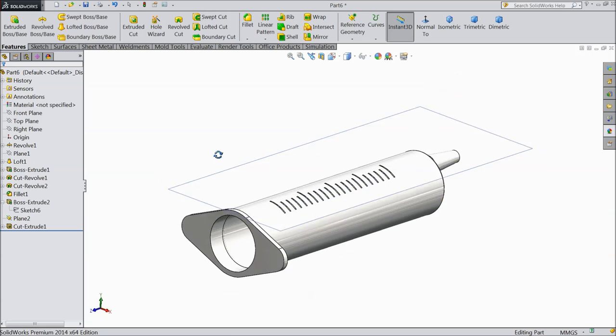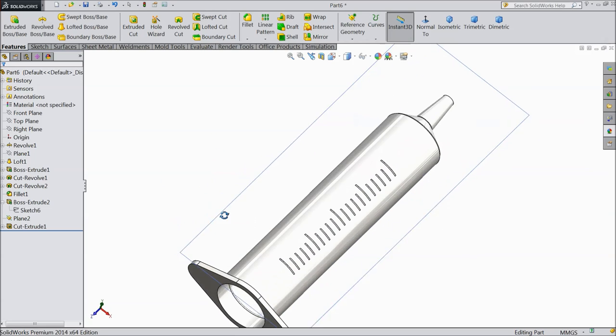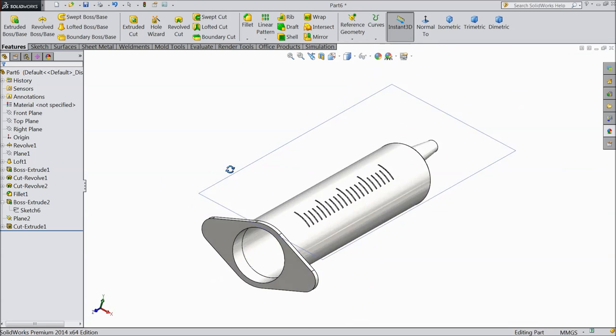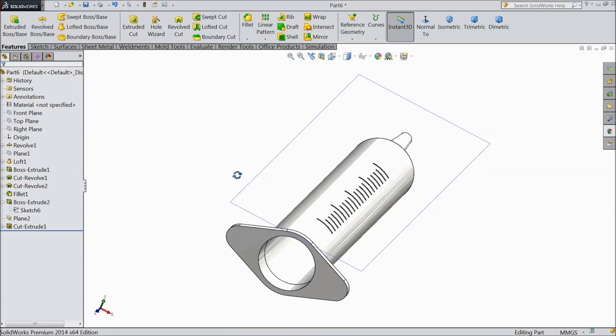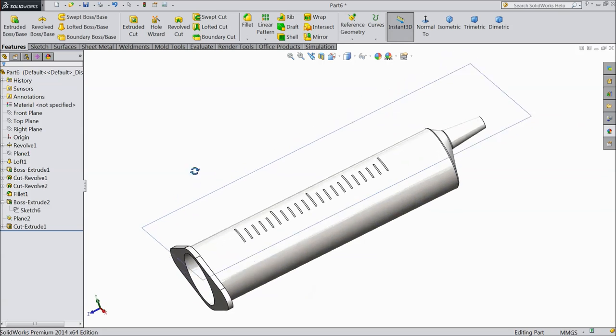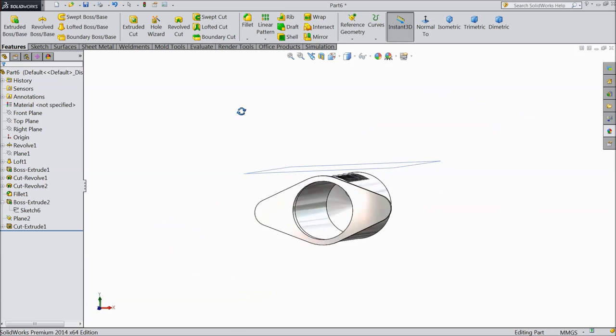Now you can see — we created the scale on the body.